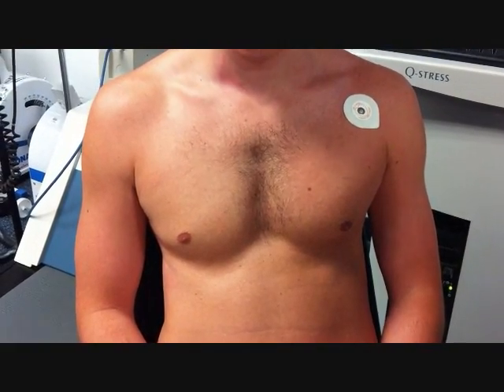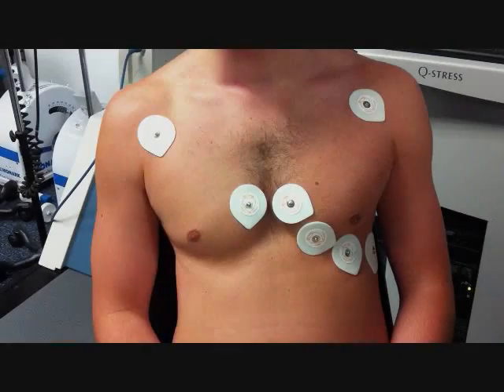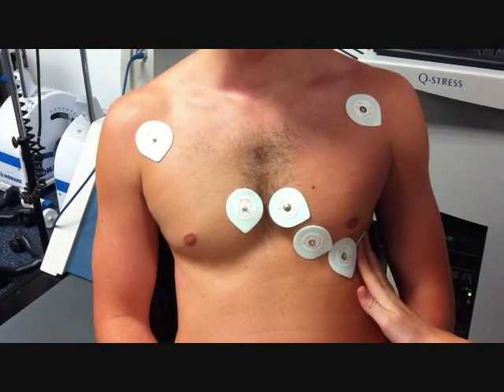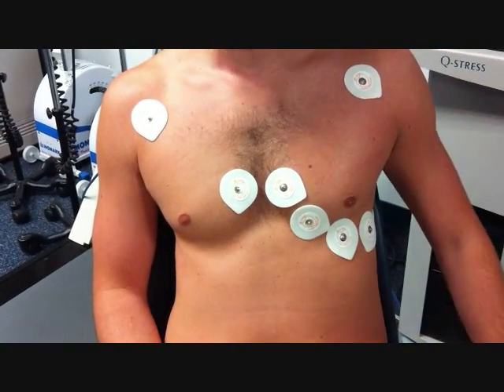This video will only be describing lead number 2. However, all leads should be considered when evaluating EKG results as they can reveal important information. The most commonly used is a 12-lead EKG. It consists of 6 precordial leads and 6 limb leads. The electrode placement is shown here.